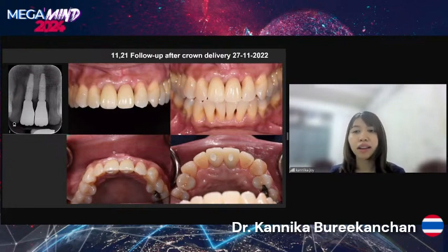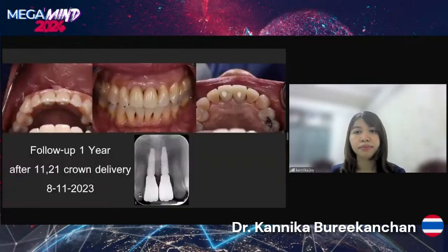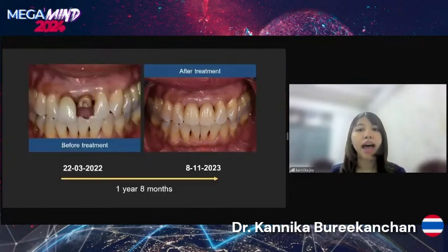Everything looks good. Follow-up 1 month. And follow-up 1 year after crown delivery, everything looked good. And this is a very long journey of this patient. She was very happy to have these both teeth.